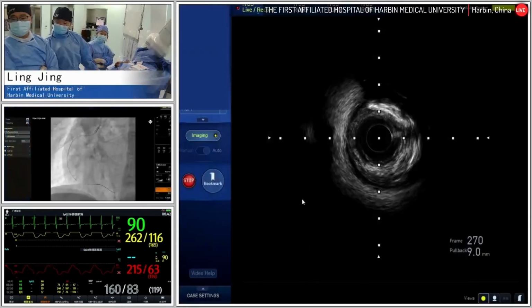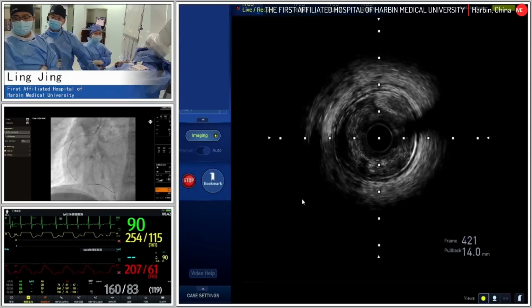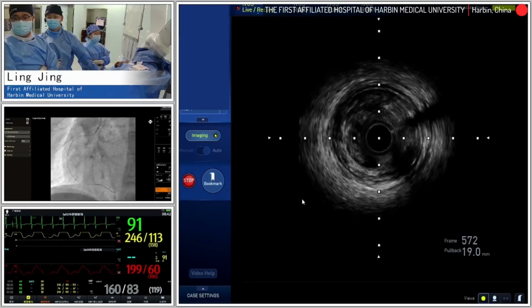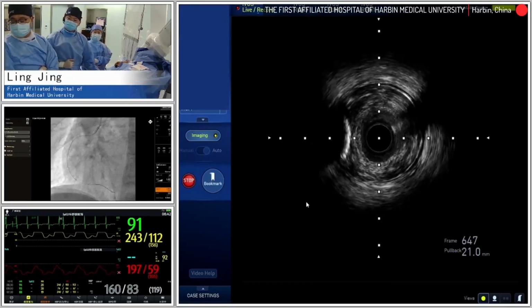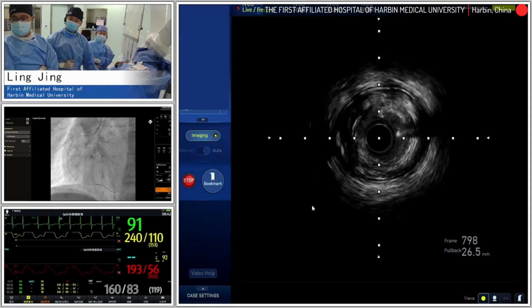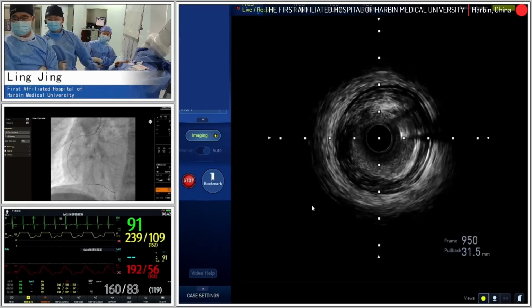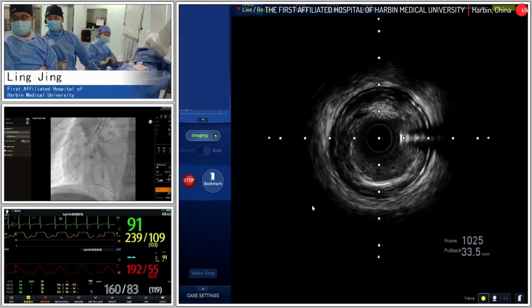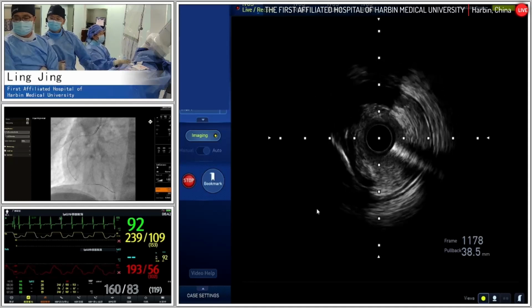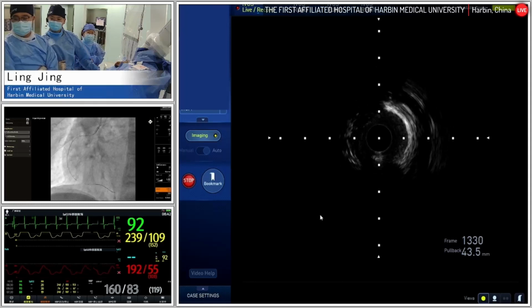So this is, like I said, for CTO lesions, after the initial recanalization, sometimes the vessel size doesn't seem to be in the right situation. So give a vasodilator and some time for the artery to get away from the spasm due to the long occluded situation. So it is of key importance. This is very important for us to choose the right size of the stent. Otherwise, a relatively small stent size carries a high risk of stent underexpansion.